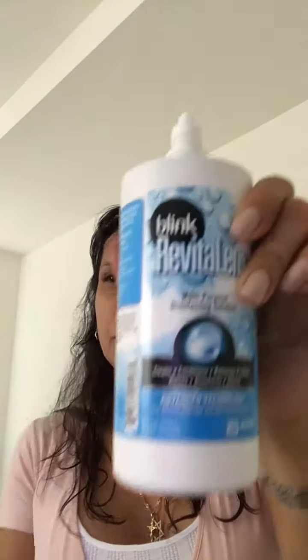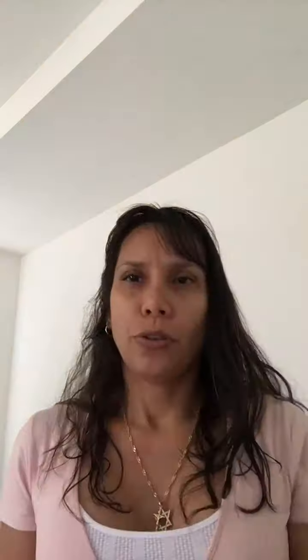I recommend a multi-purpose solution for cleaning, disinfecting, rinsing, and storing your contact lenses. Remove your soft contact lenses before removing your makeup, and clean your contact lenses every time you remove them from your eyes.